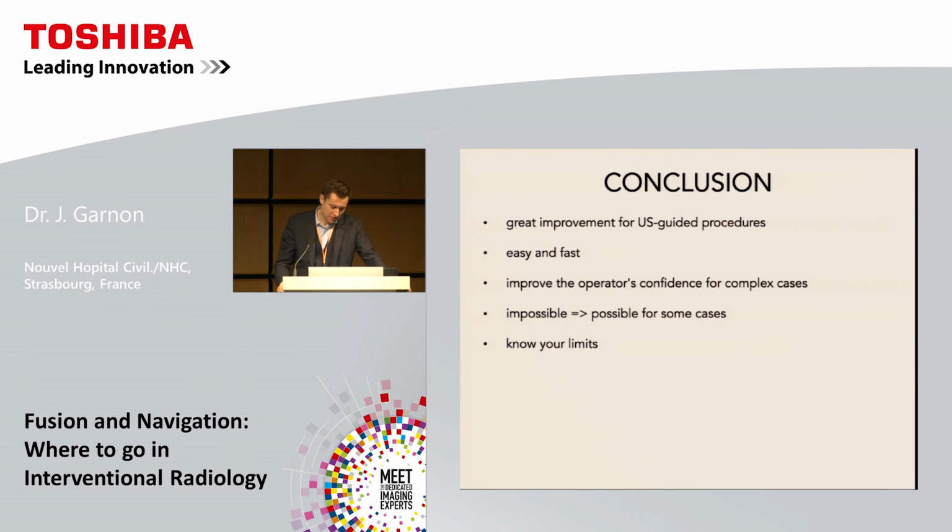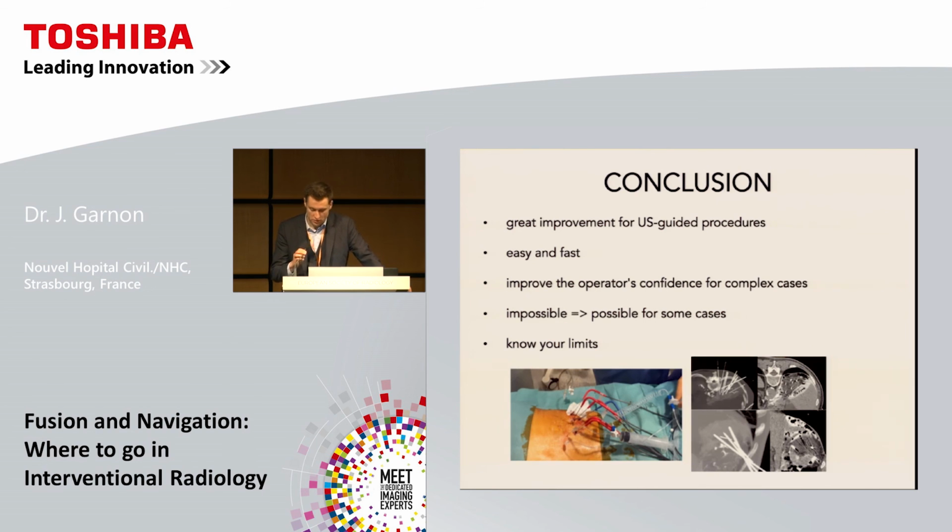So as a conclusion, I think these tools are really a great improvement for ultrasound-guided procedures. It's easy and fast to perform, 5 minutes on average. You can clearly improve your confidence for complex cases. For some cases, you can perform interventions that wouldn't have been possible with ultrasound alone. And of course, you have to know your limits. I'm not saying that you can do such a procedure with ultrasound guidance. Of course, we will still continue to use CT guidance for such a cryoablation.